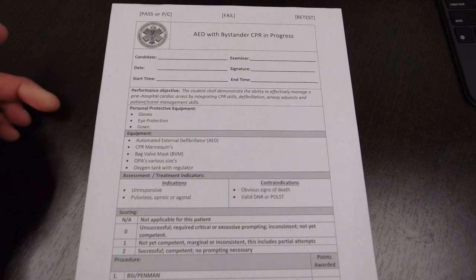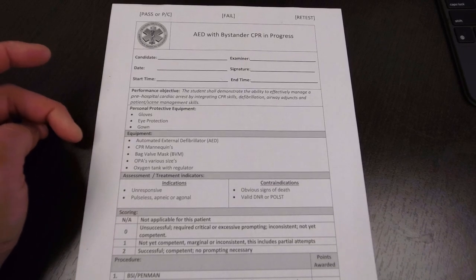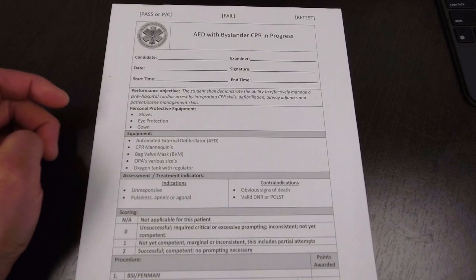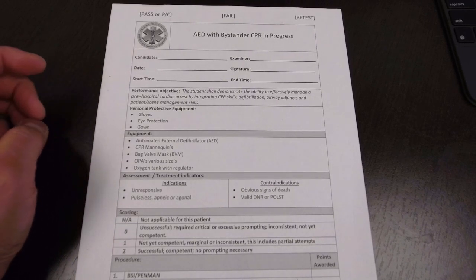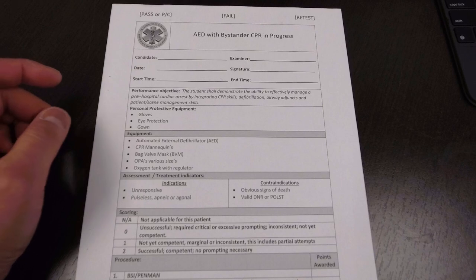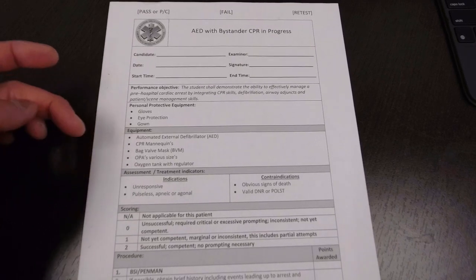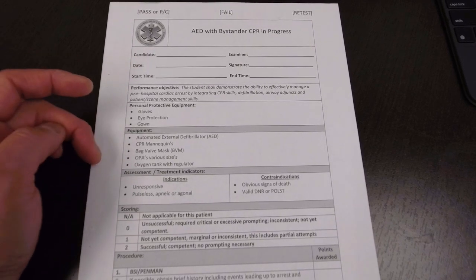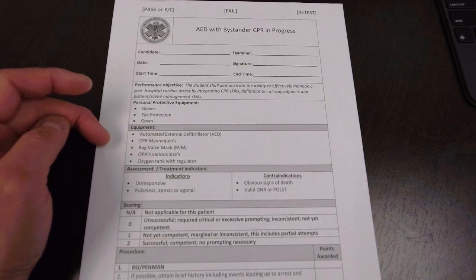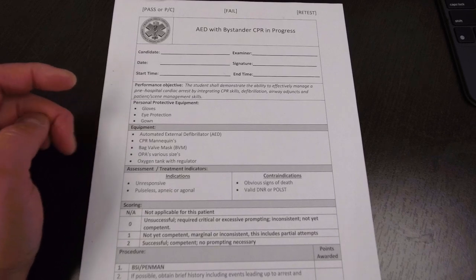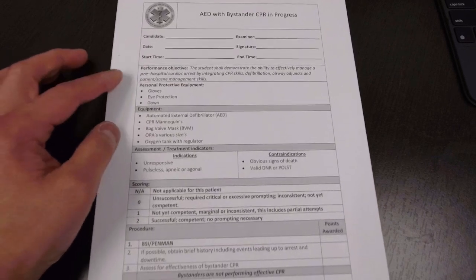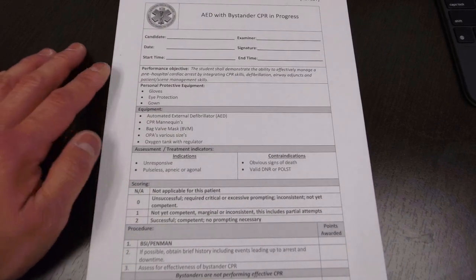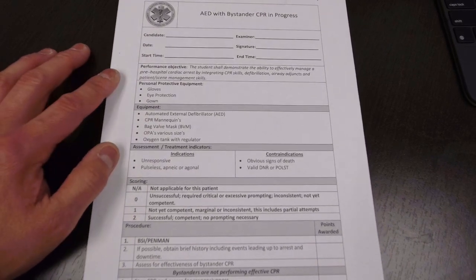And the equipment: the AED, CPR mannequin, bag valve mask, OPA with various sizes, and O2 tank with regulator. That's going to be a little bit different from your AHA. You did not have the OPA or O2 tank with regulator for the AHA version of it.